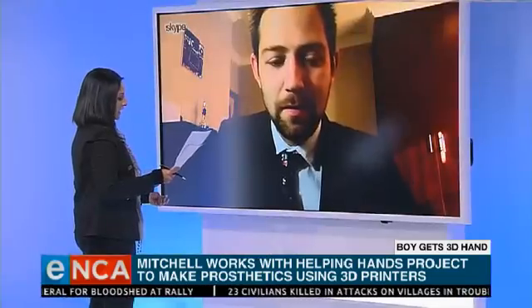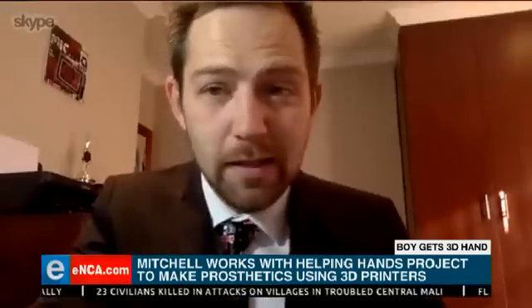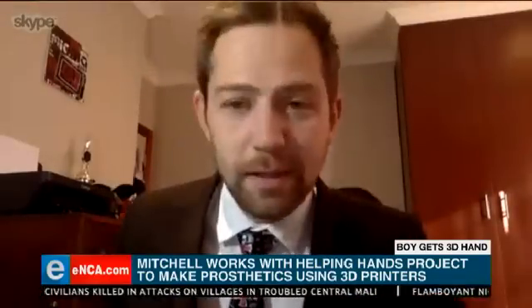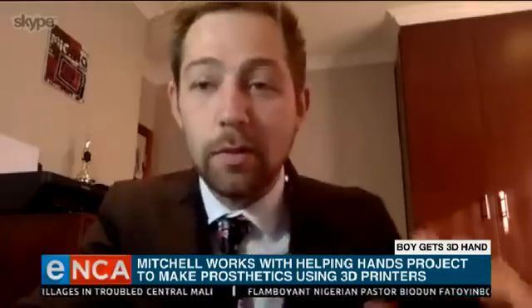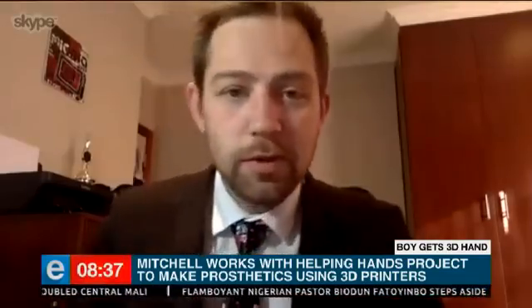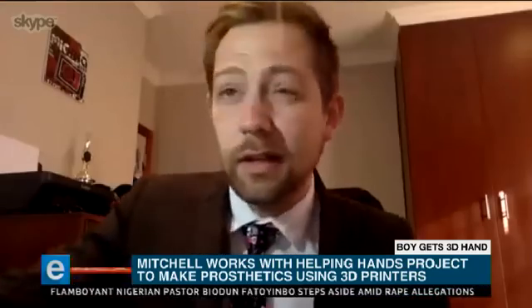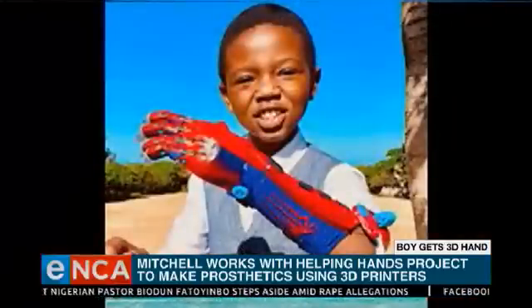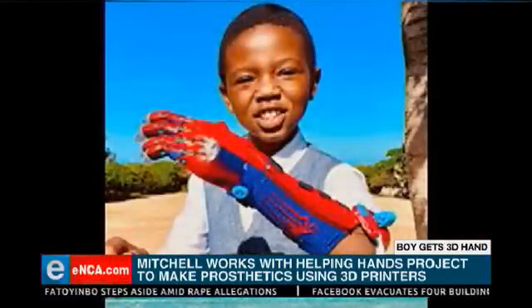I'm going to call on my five-year-old self here and ask you — does it shoot spider webs? I'm actually busy with an attachment design using magnets to put various attachments to hold pins and all sorts of stuff. For Apelele's hand, it's not yet with this prototype or the next one, but when we start adding the attachments I promised him I'm going to make him a laser attachment, a flashlight, and a web shooter.